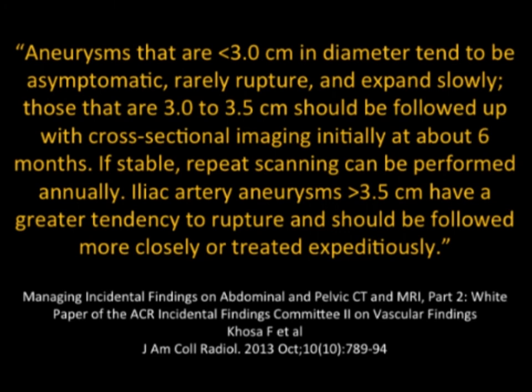Now, when we get past the abdominal aorta and iliac vessels, we recognize that essentially any vessel in the abdomen can have an aneurysm. Now, of course, there are certain conditions, Ehlers-Danlos, Loeys-Dietz, maybe Marfan's, where the frequency of aneurysms is more common. But again, we're talking about here incidental findings. We're not talking about the syndromes when there's high suspicion and we're much more aggressive in terms of management. We're talking about these other cases, incidental findings.